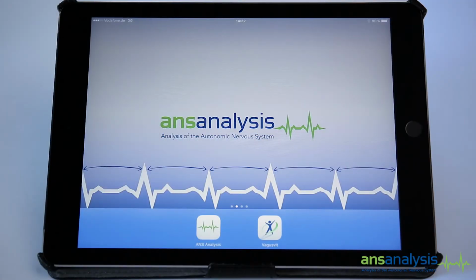In this video, we will demonstrate for you how to properly operate the ANS analysis. In order to perform a measurement, attach the chest strap to the patient and ask them to have a seat.